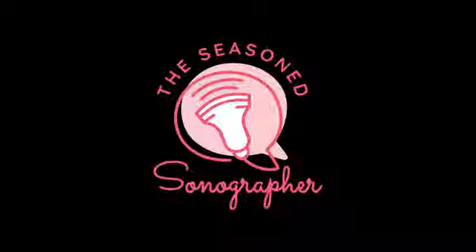The BPD measures the head, and that can be affected by head shape, such as brachycephalic, where the BPD measures wider and the head shape appears more round, or dolichocephalic. The dolichocephalic is when the head is elongated and the BPD will be shortened. The head circumference is more accurate for growth than the BPD alone.